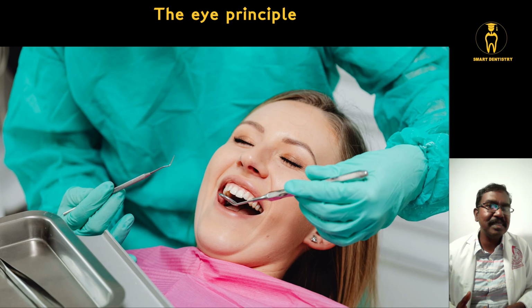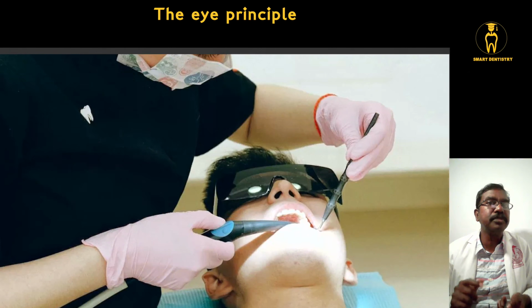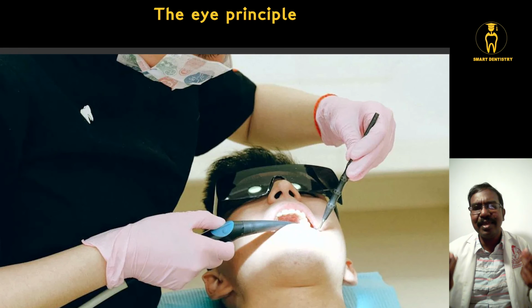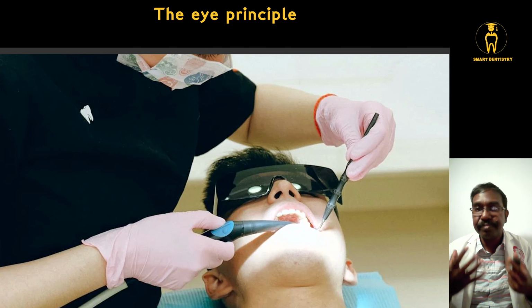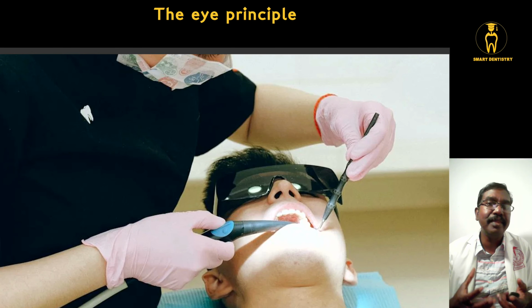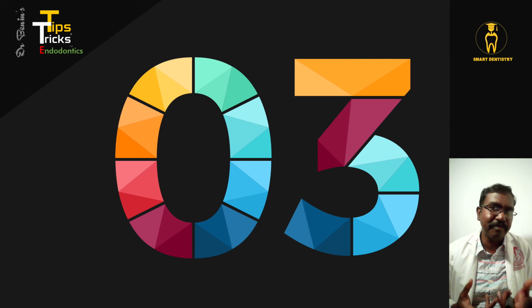So always insist the patient keep the eyes open so that it is easy for the patient and also for you to do the treatment. If you are worried that some dust particle or debris might go inside, you can give a goggle or an eye shield so that the patient's eyes will also be protected. At the same time, you and the patient are both very comfortable.